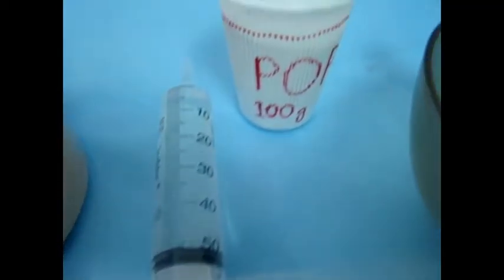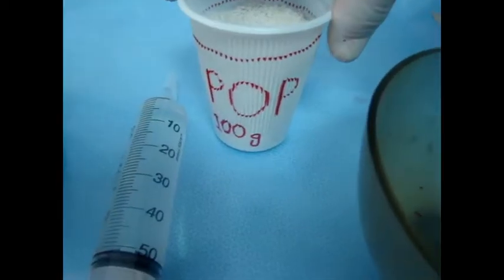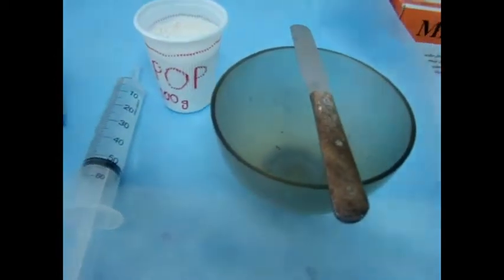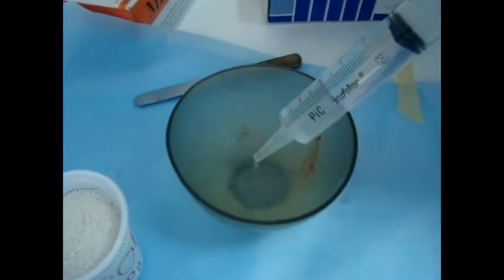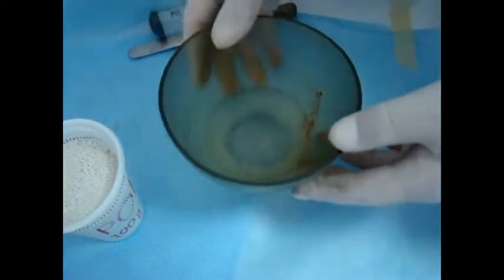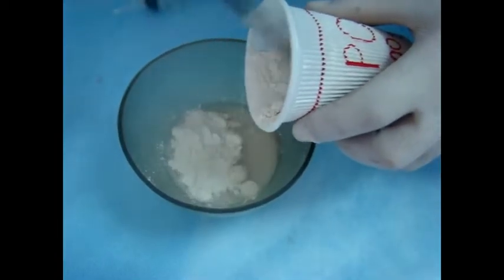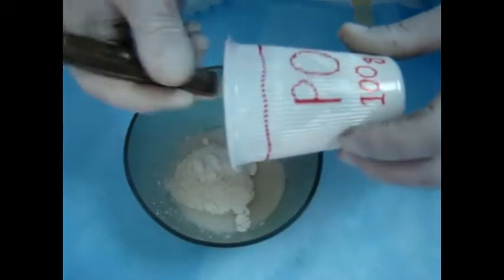Now we have the impression. We need to make a cast by pouring the impression with plaster of Paris. We need 50 ml of water and 100 grams of plaster of Paris powder. We first add water to the rubber bowl, and then we add the powder.